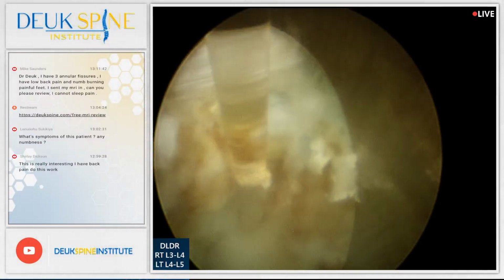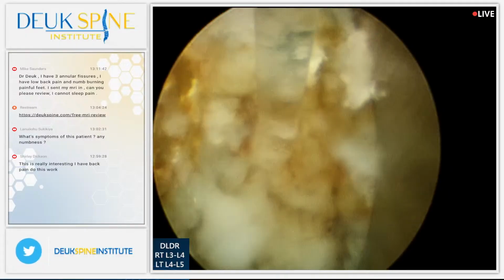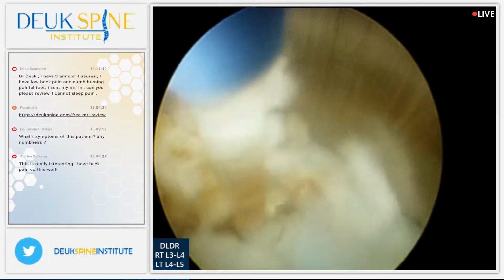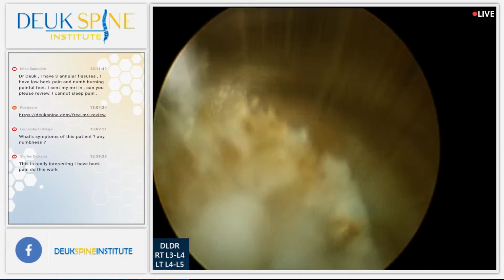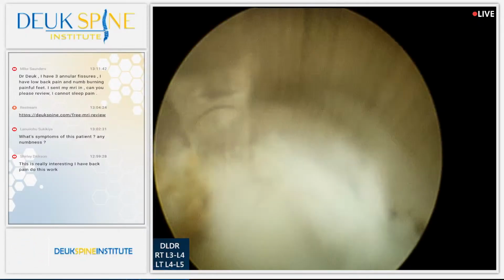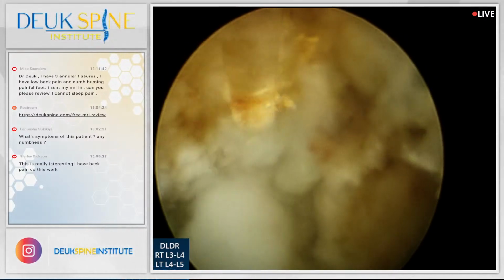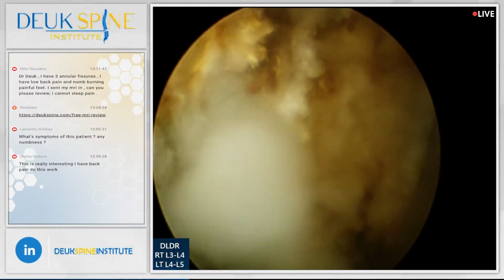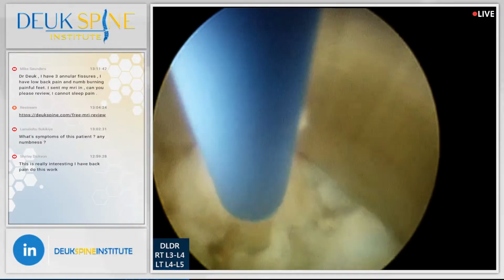All right, this is the tear right here. You're seeing it left to right. We're looking down the tube. Remember, I showed you guys this tube. It's 7 millimeters wide, and look how precise the laser is. That glass fiber is 1 millimeter wide, and it's delivering laser energy from a laser machine here at the patient's feet. There's some more inflammatory tissue right there. I just zapped it with the laser. That's where his pain is coming from.